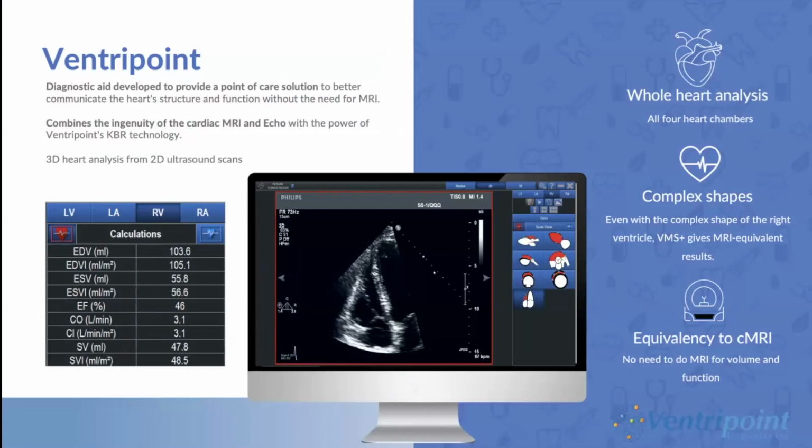It does provide all 4-chamber analysis. So it does left ventricle, left atrium, right ventricle, right atrium. It copes with these complex geometric shapes, particularly in patients who have cardiac disease, in particular volume overload. And it's been shown to correlate very well to cardiac MRI findings in various studies.